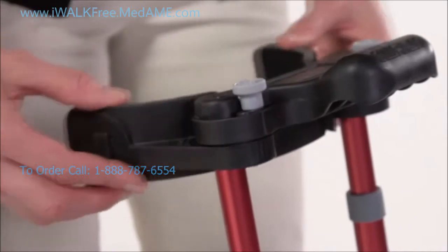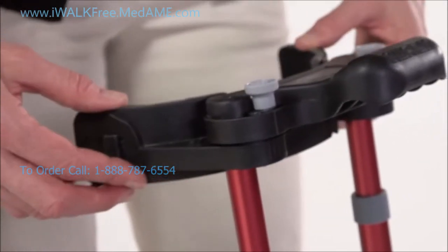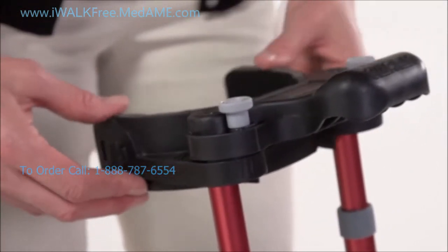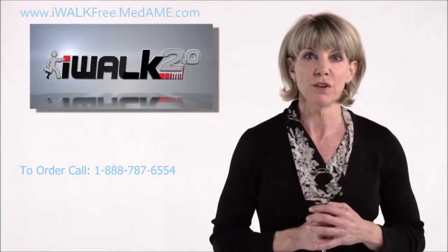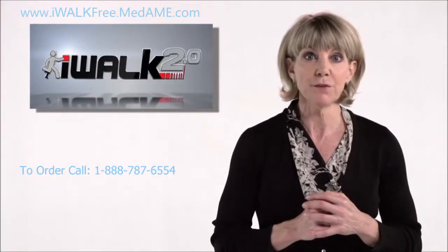Next, make sure the thigh support thumb screws are loose and that the supports can rotate. The next step is really important: orienting the foot for left or right leg use.